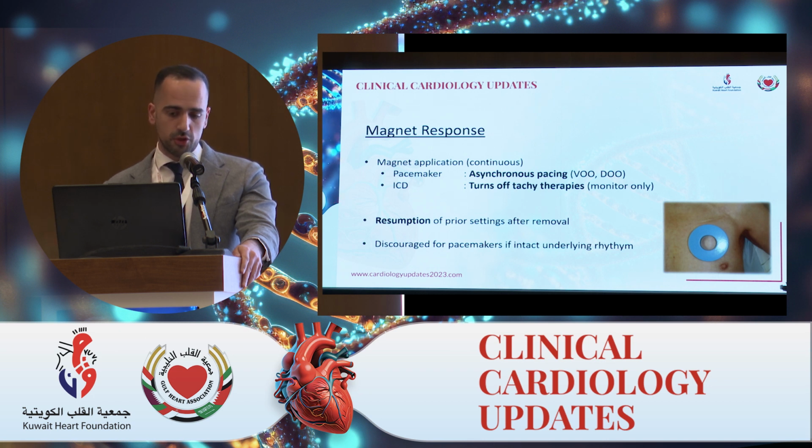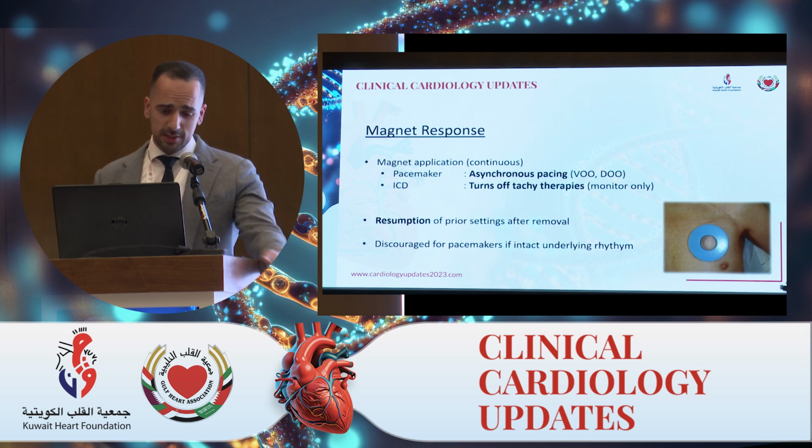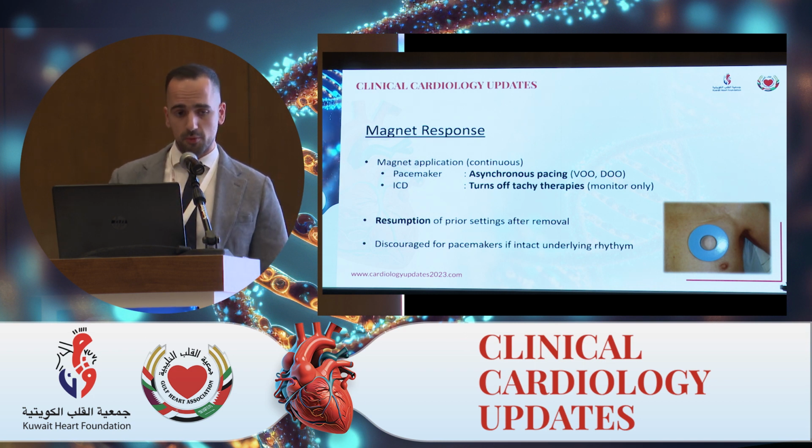In pacemakers, however, putting on that magnet will switch them from whatever programming they are to asynchronous pacing. And if you remember chamber paced, chamber sensed effect, it will basically pace a chamber without looking, without doing anything. It's just pacing, pacing, pacing at a fixed rate. This is very safe in patients who have no underlying rhythm and are dependent. However, in patients who have an underlying rhythm, asynchronous pacing theoretically can be dangerous. So it is important to make sure of that before putting on a magnet in a patient with a pacemaker.